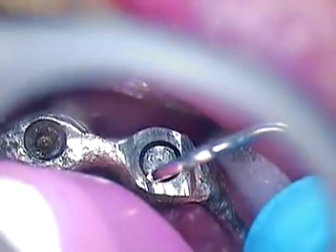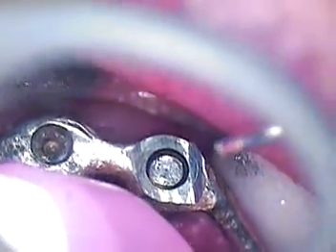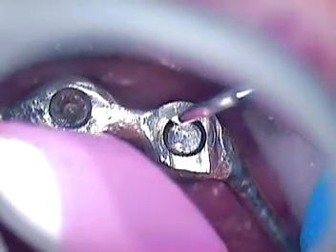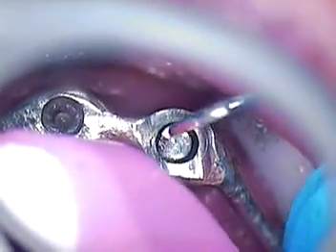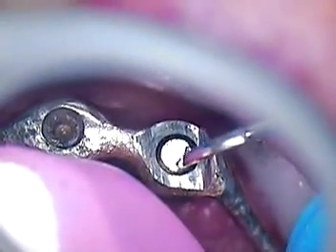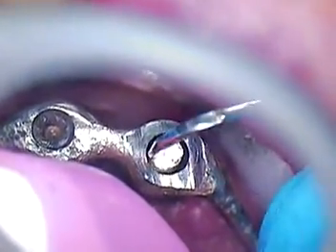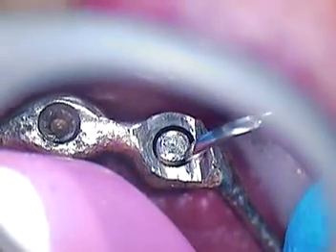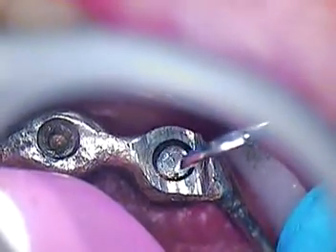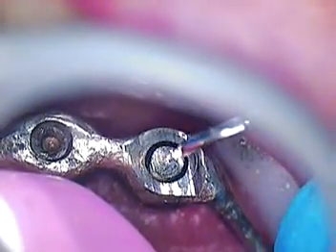Oh, isn't that a beautiful thing? Oh, you bet we're taping. I'm here with Robert Marrero of Straumann, and he's shaking his head. He's saying, good job. This is good stuff. We're finally saving the day for our patient here. I did speak to the patient's dentist, and we discussed parts of this procedure in depth, but it's nothing better than when it happens.